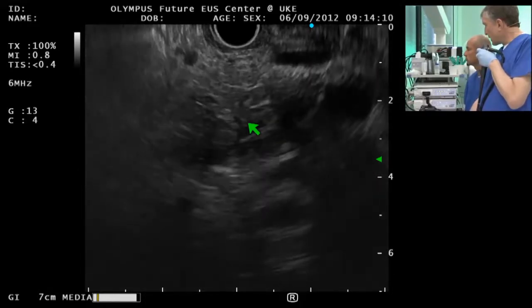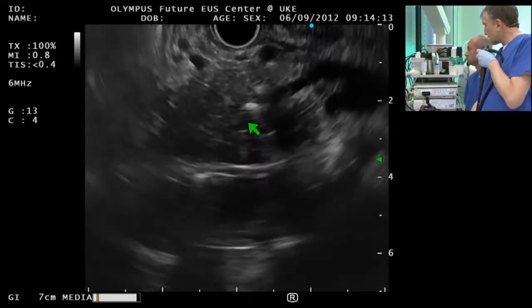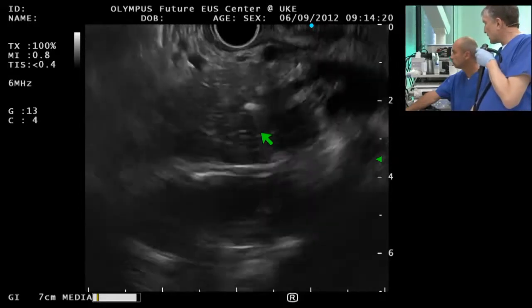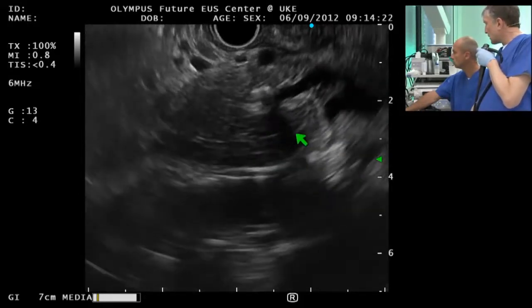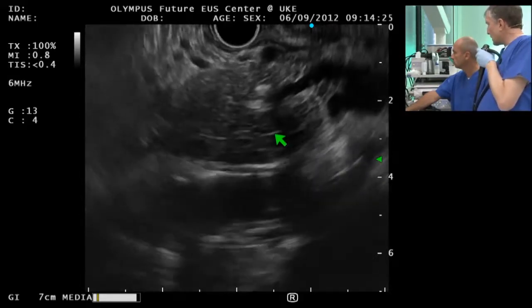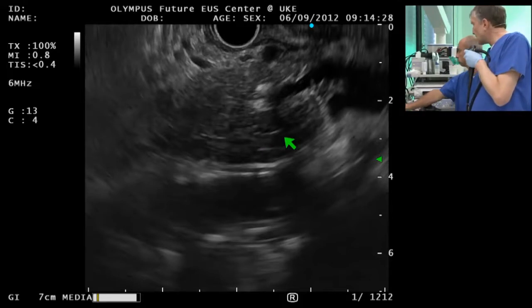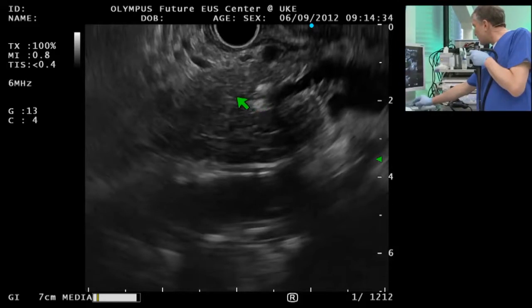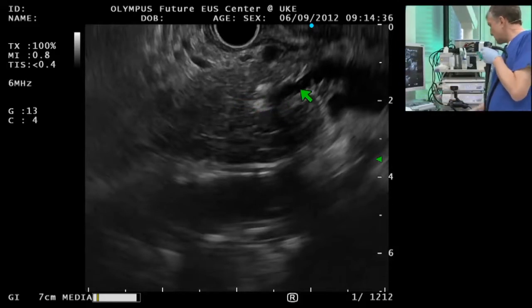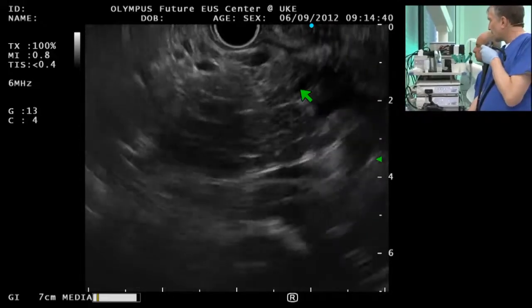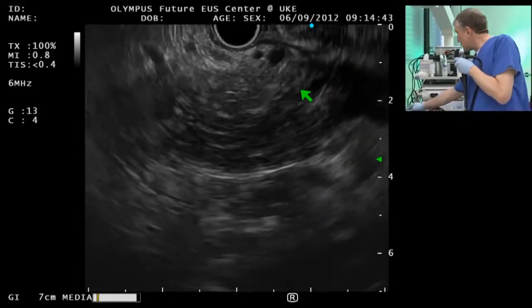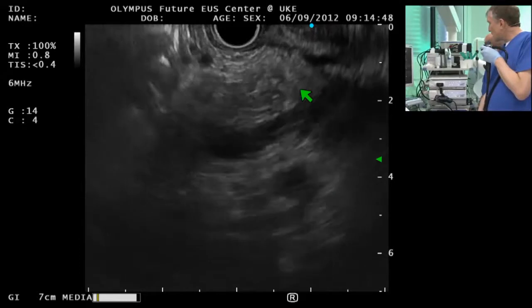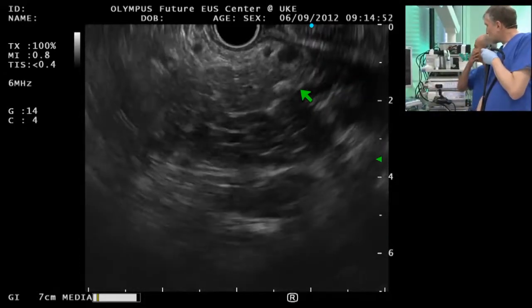So what do you think about the parenchyma? Hypoechoic. Do you think we have a tumor suspicion there? No, I wouldn't say. It looks homogeneous. So it looks like an encasing calcification on both sides, so the duct is compressed here. Here's the duct proximal to the obstruction. Here's the dilated duct. So it looks like chronic pancreatitis.